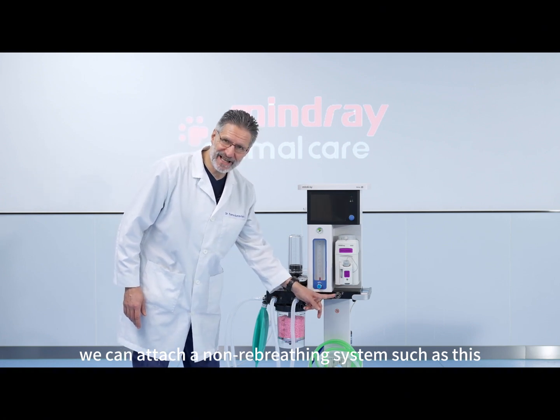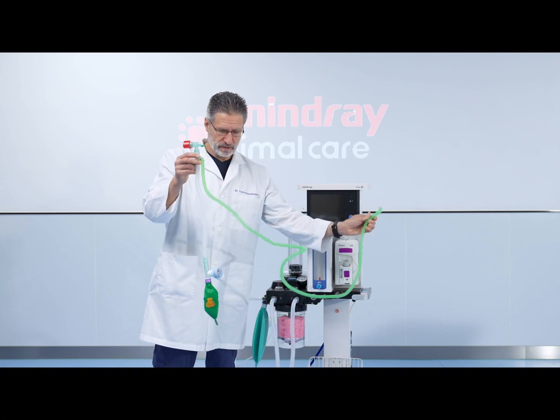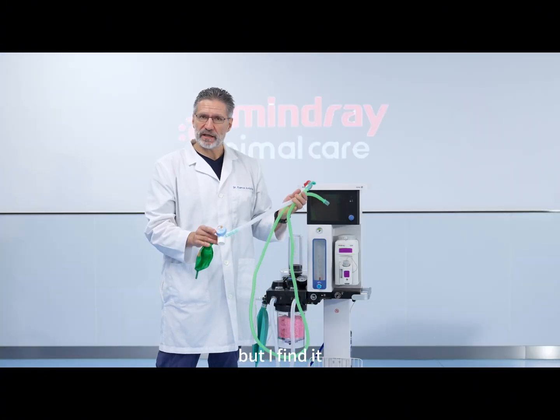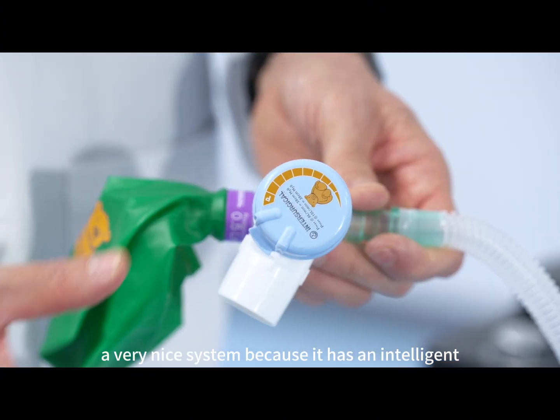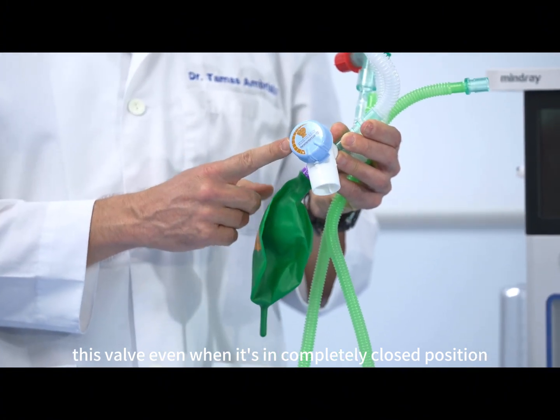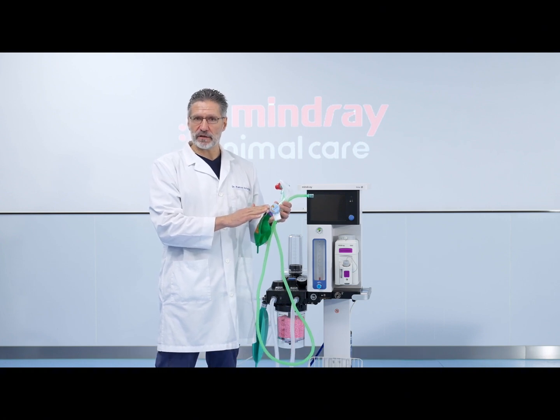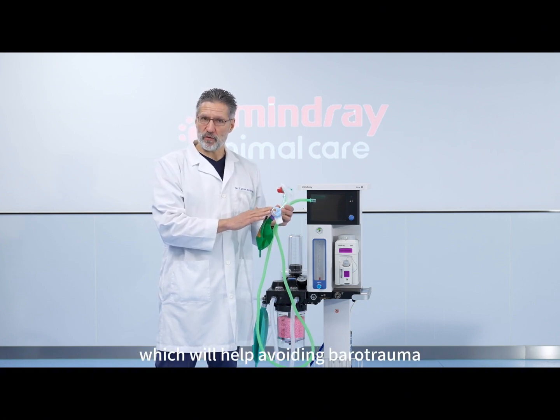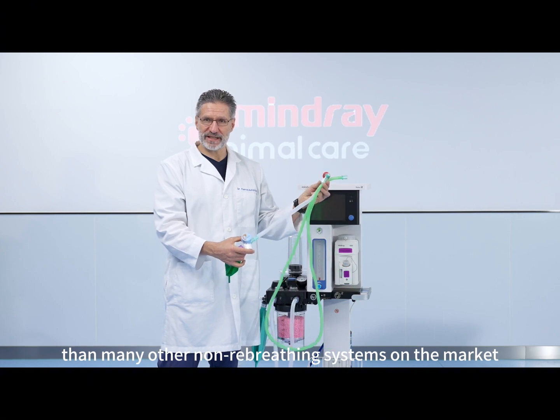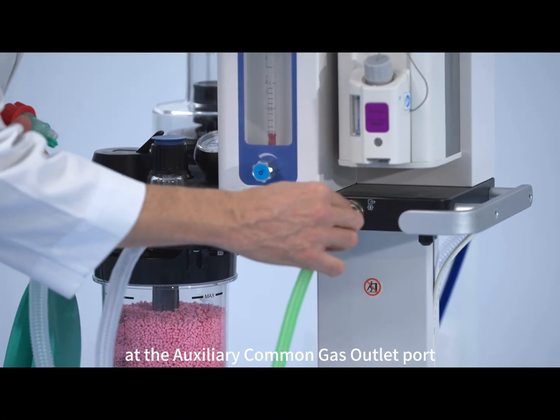We can attach here a non-rebreathing system such as this Mapleson D system from the Intersurgical company. This is just one example of a non-rebreathing system, but I find it a very nice system because it has an intelligent graded APL valve, and this valve, even when it's in the completely closed position, will open at a pressure of about 30 cm of water, which helps avoid barotrauma for your small patient. Hence I find this system is much safer than many other non-rebreathing systems on the market.